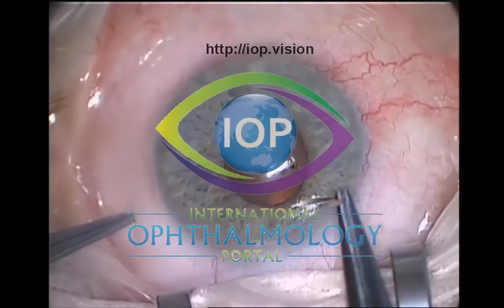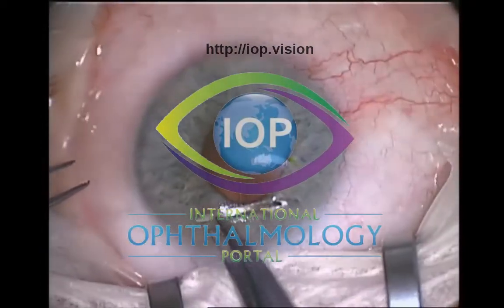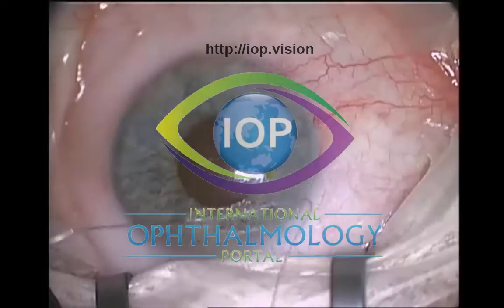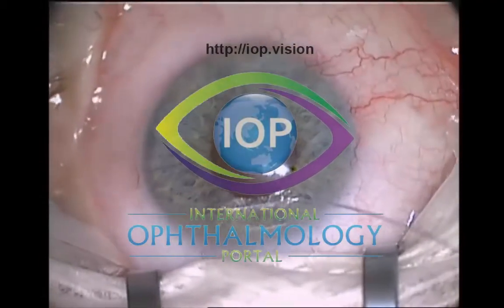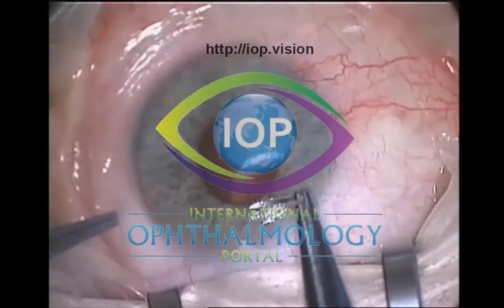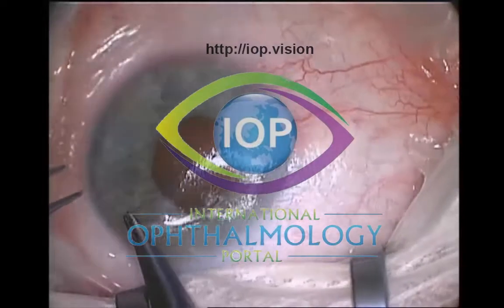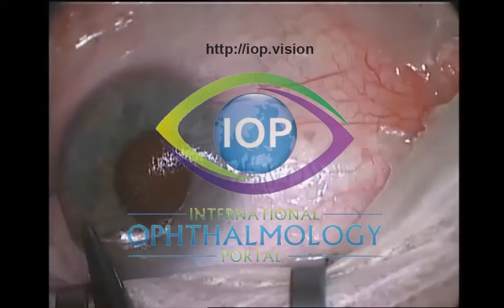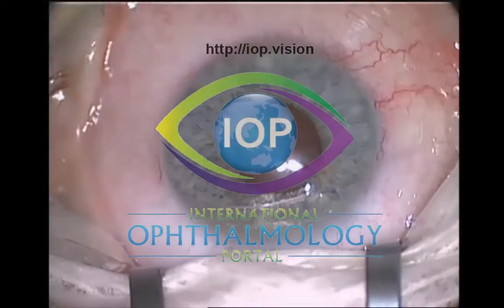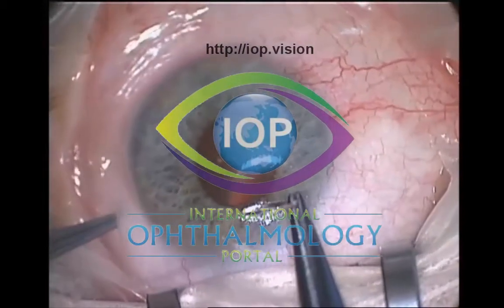Just at the point where I have the needle tip going into the cornea, I change the angle of my wrist and fingers so that the needle is relatively vertical just for the very first few moments of the corneal traction suture. Then I change the angle of my wrist by supinating the wrist, and then I kind of walk the traction suture across the cornea, staying within the same lamella, which is the key. When I want to come out, I actually hold the heel of the needle, and that will actually bring the tip vertically outwards at the point when you decide to do that.